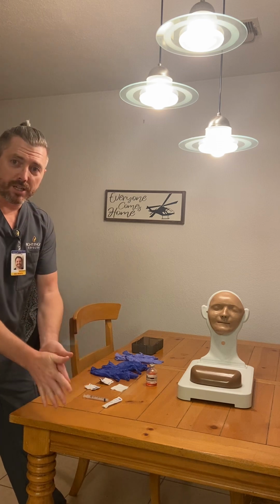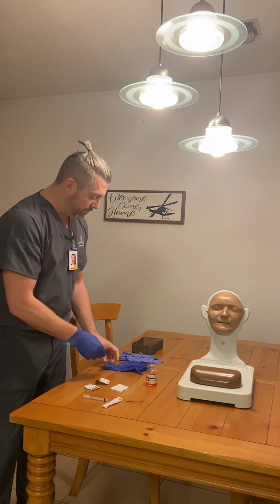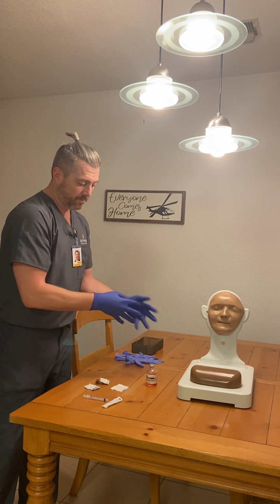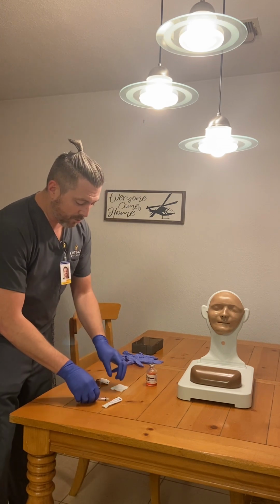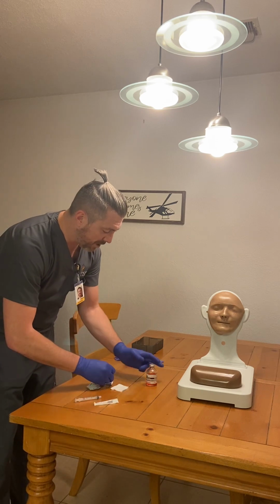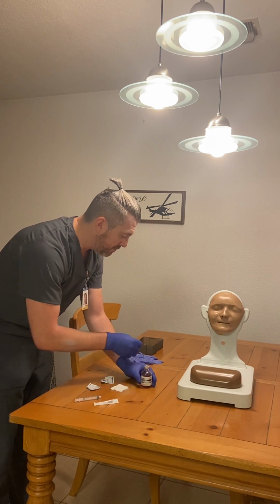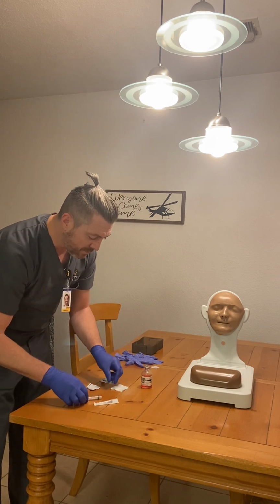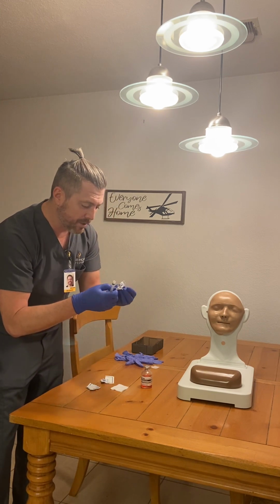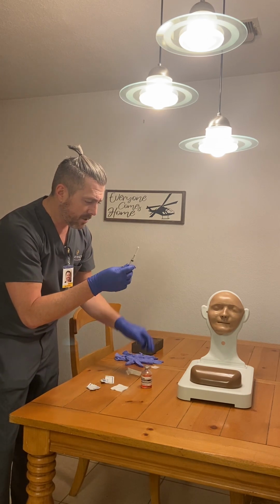So I'll perform hand hygiene again and put gloves on. I'll get ready to draw up my medication. We'll grab our syringe and pull everything out of a fresh pack. First I'm going to pop the top of the bottle of morphine sulfate. I'm going to clean the top with an alcohol prep and throw that in the trash. And then I'm going to put the syringe onto the top here, and hold it in one hand.